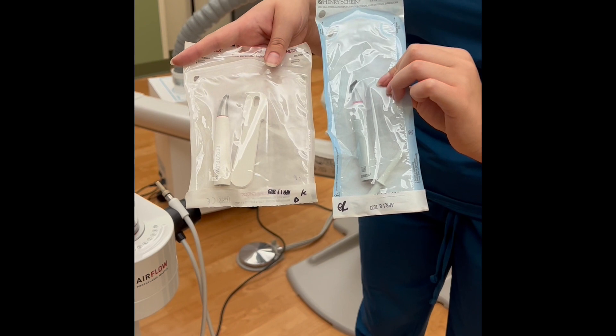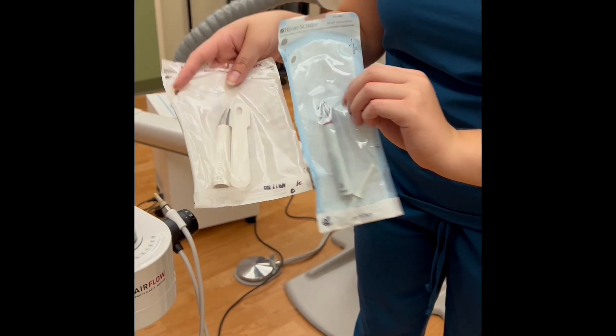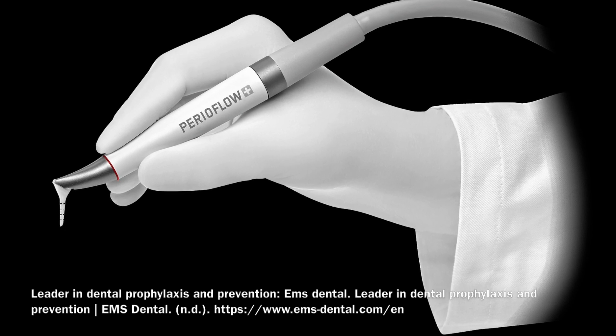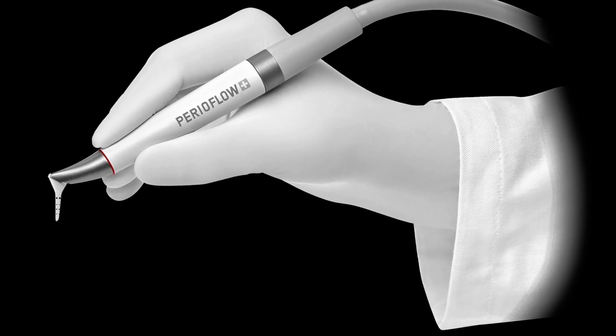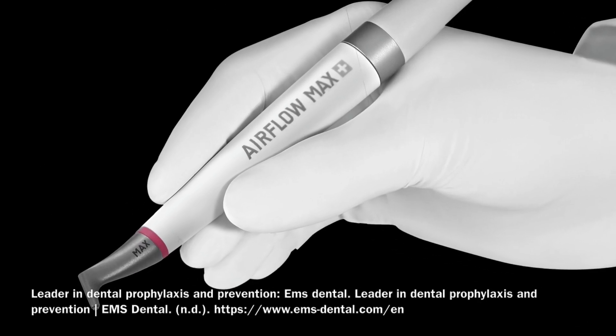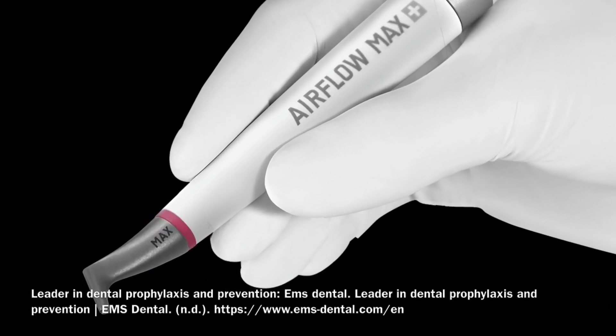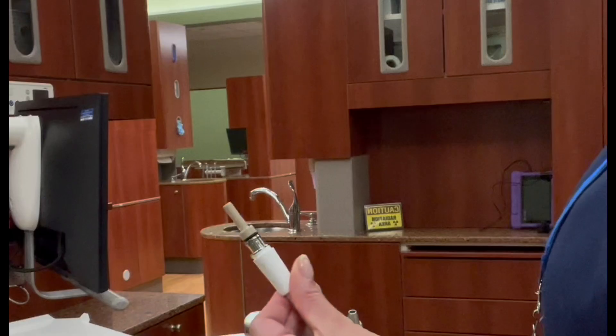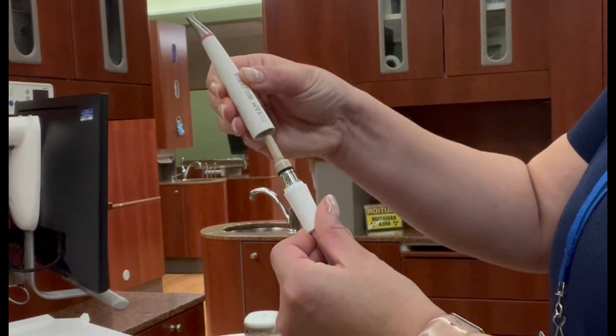There are two types of handpieces available for use with the Airflow. The PerioFlow handpiece is used for subgingival applications, and only the Airflow Plus Powder should be used with this handpiece. The original Airflow Max handpiece can be used with both the Classic and the Plus Powder. To connect the handpiece, simply push it straight down onto the hose.